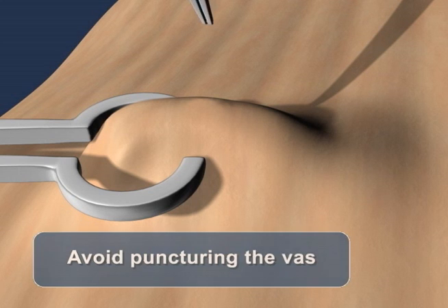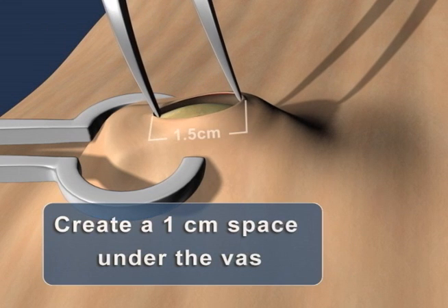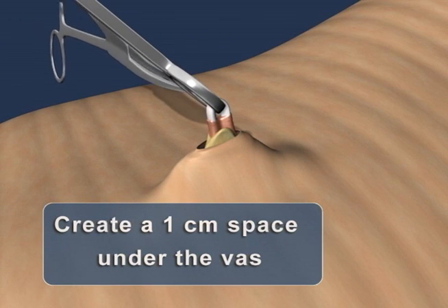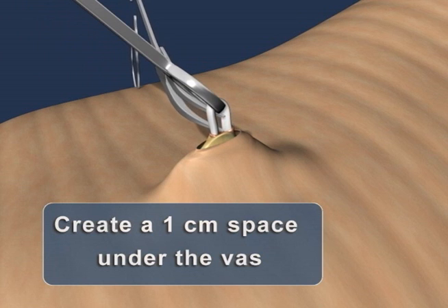It is only necessary to dissect away the mesenteric tissue sufficiently to expose a loop of bare vas large enough to allow for the passage of the lower jaw of the ProVas applier.